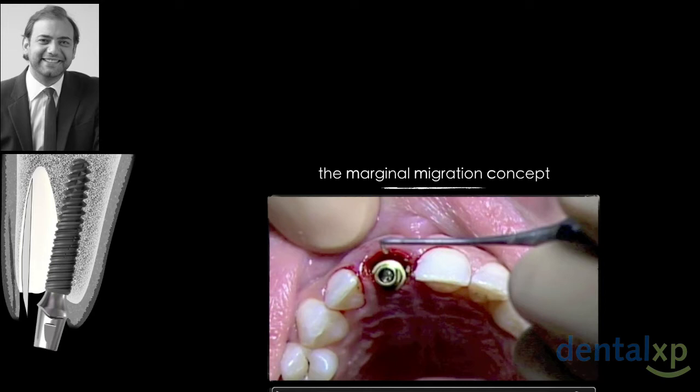Now, we not only preserve the bone, but with this slow resorbable membrane we have a barrier in order to keep a tent for our soft tissue, but we also go a bit supracrestal and graft even a bit further coronally.